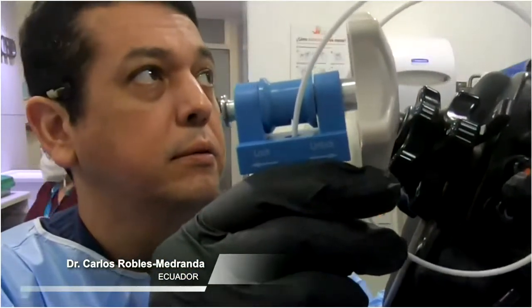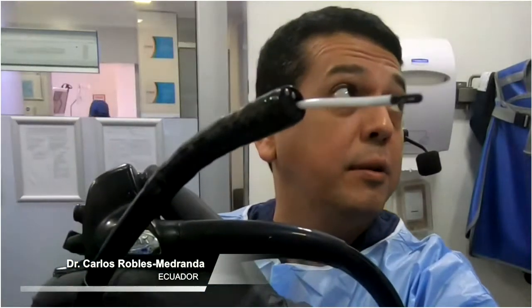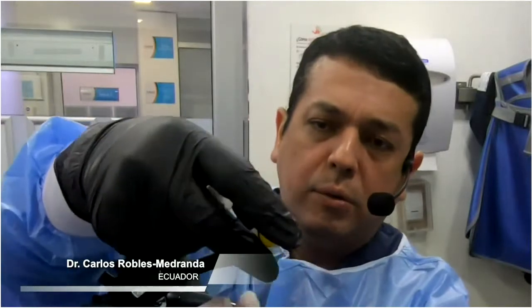So this is the Microtech band ligation. It's very similar to the Cook one. So you have an unlock and lock area. And then when we have the distal part outside of the scope, we need to catch this. Now you can see, and now we introduce it inside the working channel of the scope, and we will recover this outside. So you see the distal part. Now we need to introduce this inside, in the distal part of the scope.